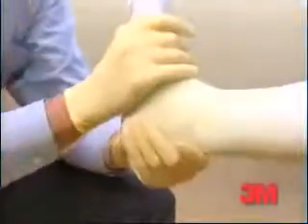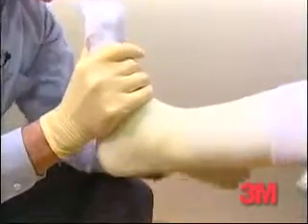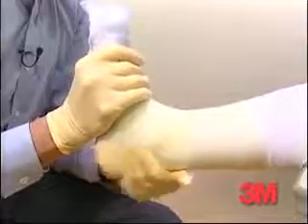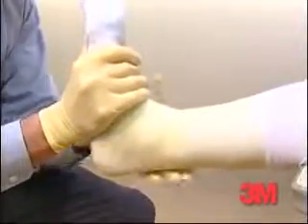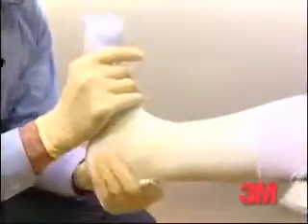And now we'll just mold and make sure that we maintain 90 degrees of dorsiflexion, plantar flexion, and neutral inversion, eversion, molding around the Achilles area and malleolar area and arch.